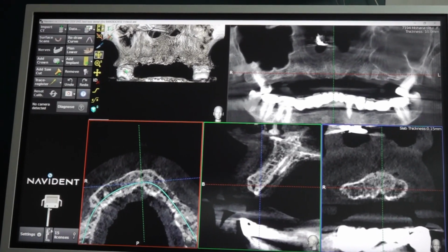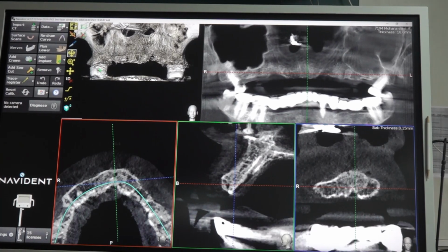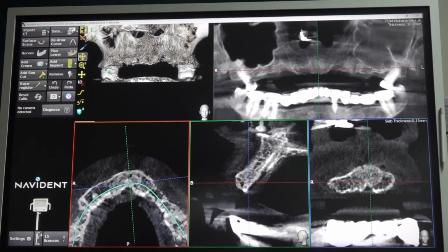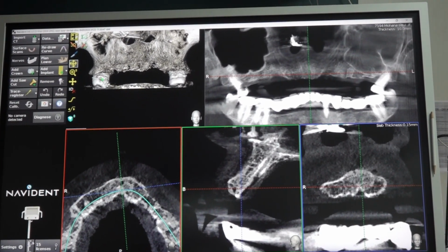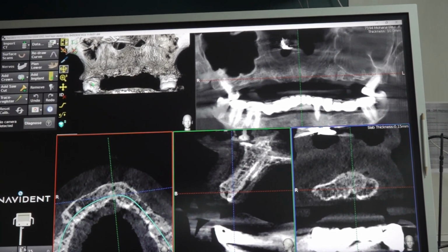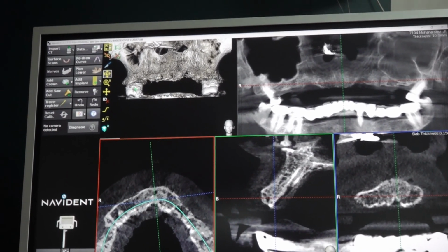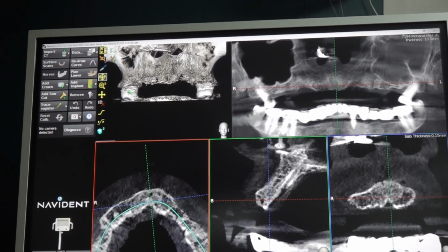But sometimes we place basal in the anterior region. Because the anterior mandible itself is cortical, not necessarily you have to go till the lower border. The entire bone is cortical for many patients. But even some patients, the lower anterior bone is totally osteoporotic. Yesterday we did lower anterior, no? The lower anterior is fully osteoporotic. That means it's better to use a compressive.